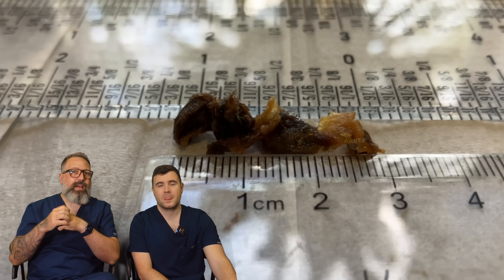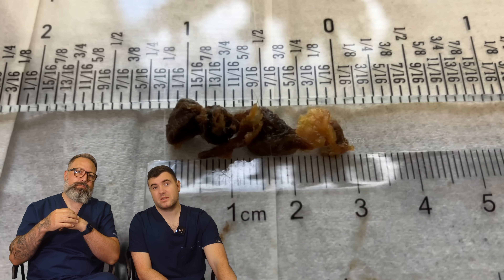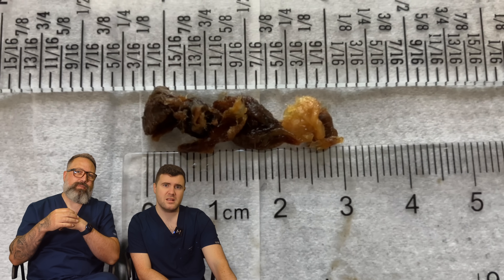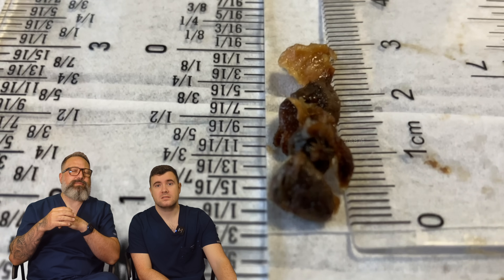Nice looking eardrum as well there. What do you want to do — inches? I'll do an inch. Just over an inch — an inch and one eighth. So what's that? I think that's three centimeters there, guys.